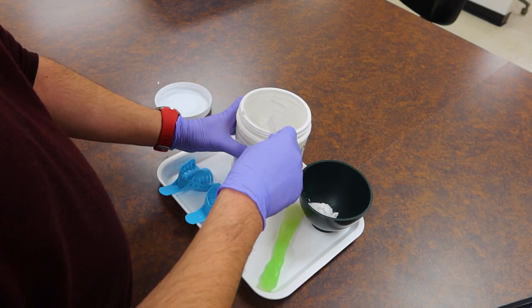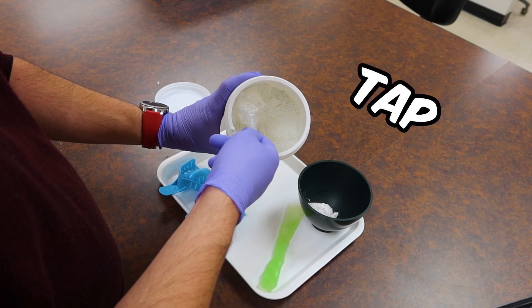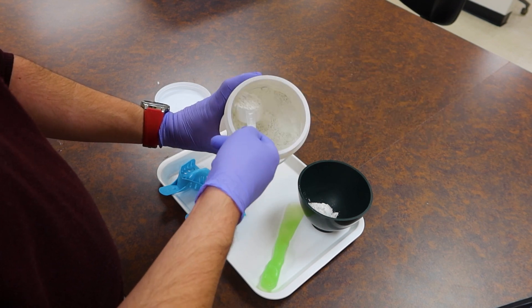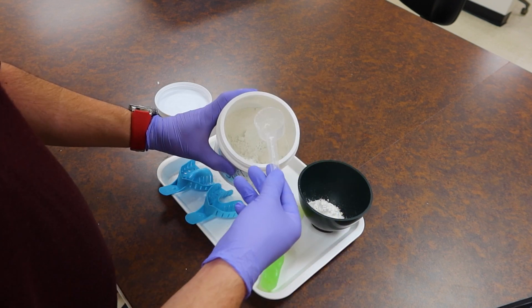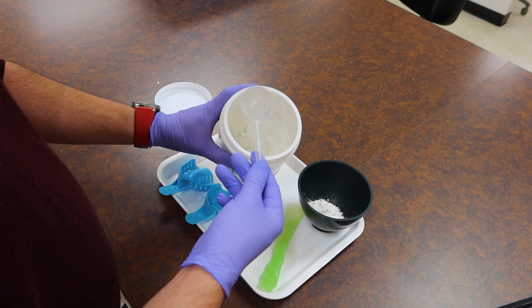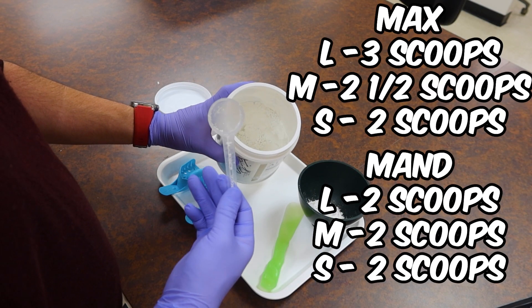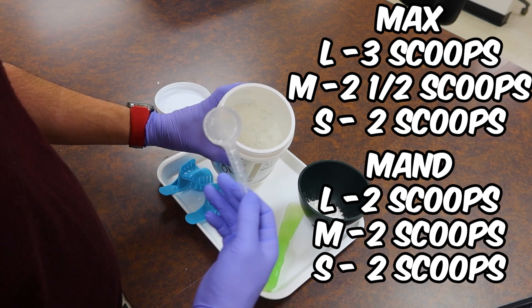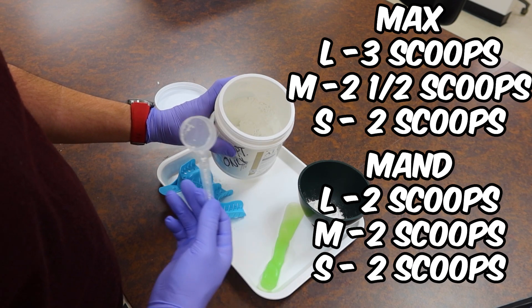Some people use the shake-and-tap technique — get a nice heaping scoop, tap against the side of the jar, and get a relatively level scoop of material, which they dash into their bin. Right now I'm taking the maxillary impression, so I'm going to need three scoops of powder because I'm using a large tray in a large mouth. Adjust for size: if you're doing a medium size, maybe two and a half or two scoops; if going small, two scoops is definitely all you'll need.